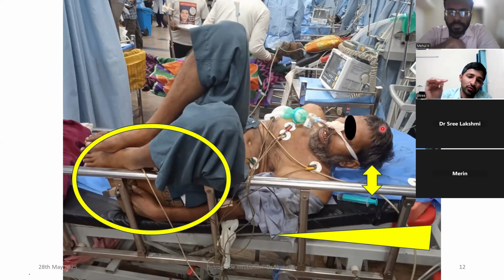Since the vocal cord is present about 1 to 2 centimeters above the cricothyroid membrane, that is at the level of almost the Adam's apple, overall we'll get a leverage of around 3 to 4 centimeters if we perform the procedure right. So make sure that you do not use jerky, rapid movements and use smooth movements in order to remove the guide wire. However, that's a real possibility that you might dislodge the endotracheal tube while trying to remove the guide wire.